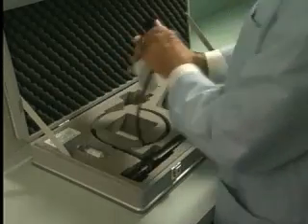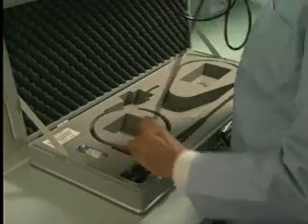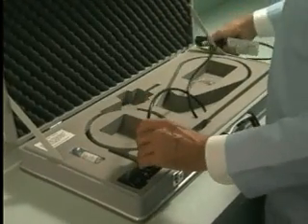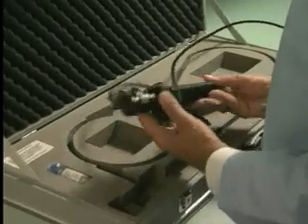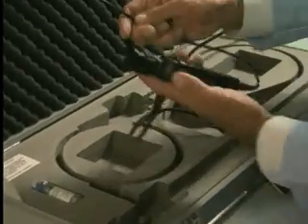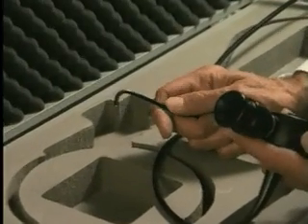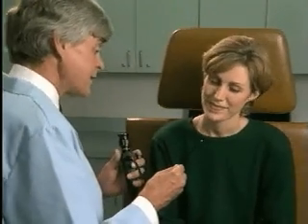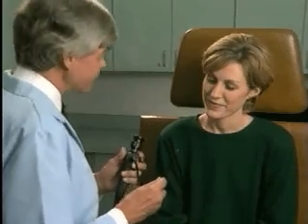The indications for a rhinolaryngoscopic examination are among the most frequently seen by a primary care physician. One study cites cough and symptoms referable to the throat as the top 2 symptoms that patients reported to physicians, representing some 17 million patient visits annually. Another recent study demonstrates that diagnostic assessment and patient management decisions are changed 90% of the time following a rhinolaryngoscopic examination.